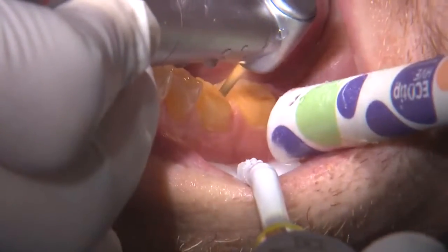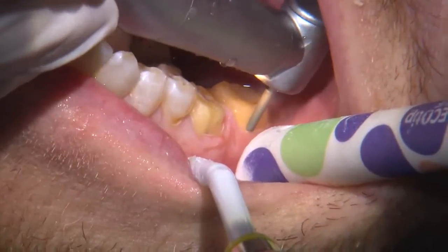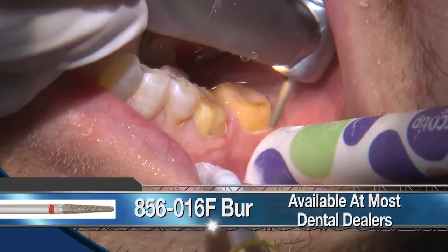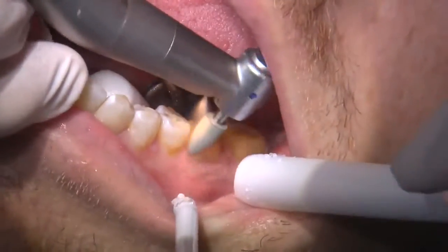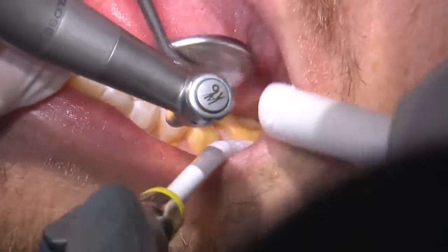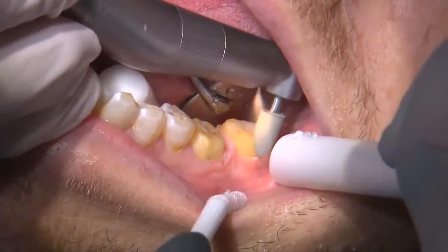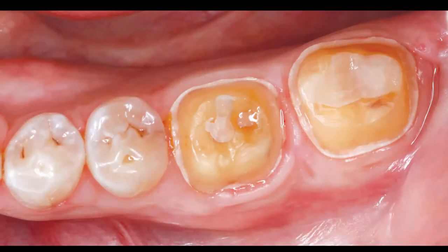And once I have most of the reduction occlusally and axially, and once the overall gross reduction is completed, I will refine the preparation with a fine, rounded, tapered diamond. And here, sometimes I do like to take a composite rubber wheel to help roll over the sharp angles. We do want rounded internal angles whenever possible. So here are the final preparations.